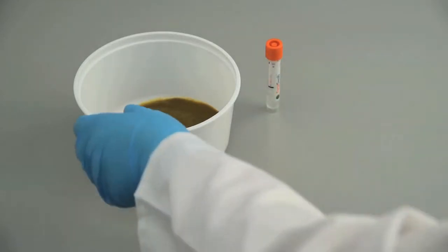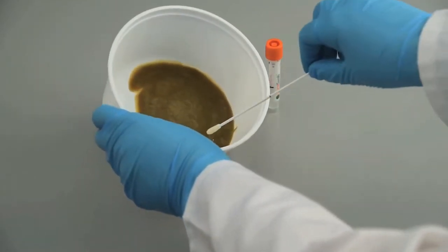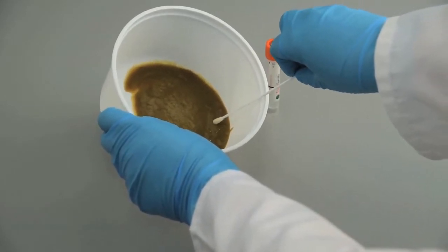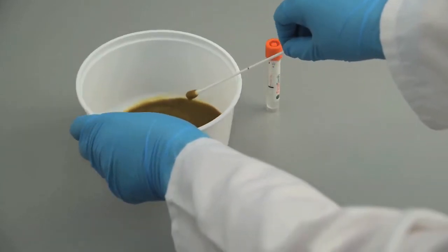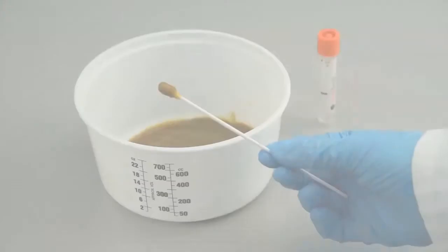Collect a small amount of stool by inserting all of the tip of the flocked swab into stool sample and rotate it. Bloody, slimy, or watery area of stools should be selected and sampled.